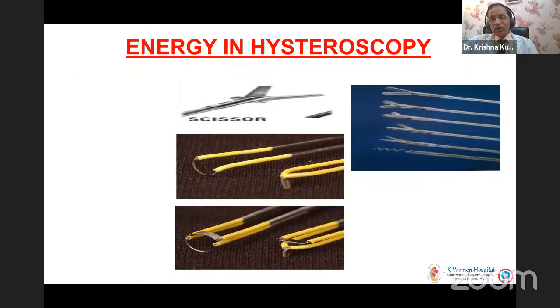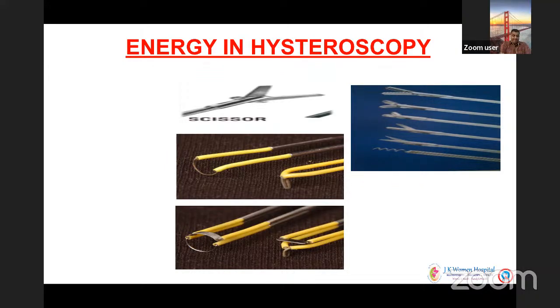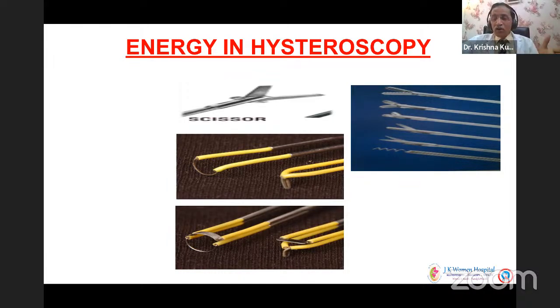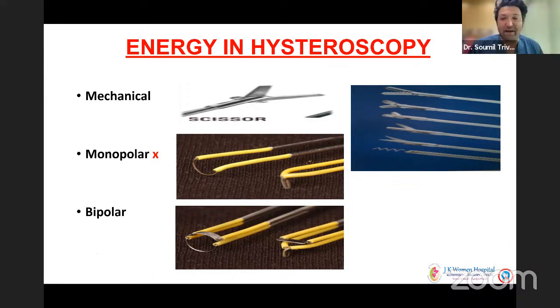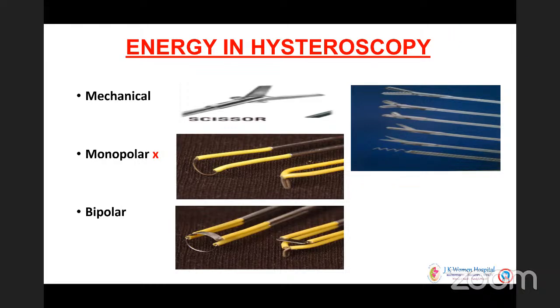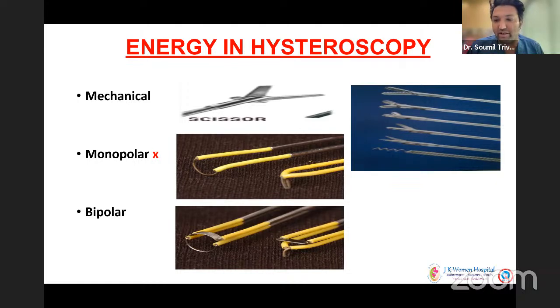Now, energy in hysteroscopy has changed. When I did hysteroscopy 25 years back, any surgery was always with that big resectoscope, loop and Collins knife. Today we ask, should we buy a resectoscope or not at all? Definitely buy, a bipolar resectoscope, preferably with a smaller diameter, and scissors as well. It is a very useful tool to have while doing hysteroscopy. I am happy that all the panelists agree that we should talk of bipolar resectoscope and not monopolar.